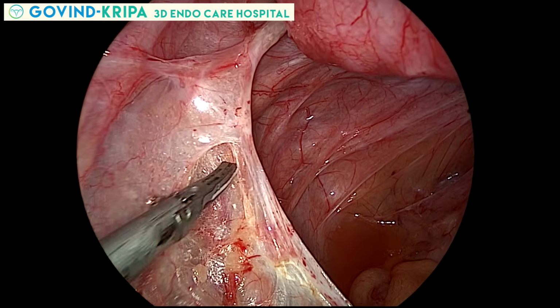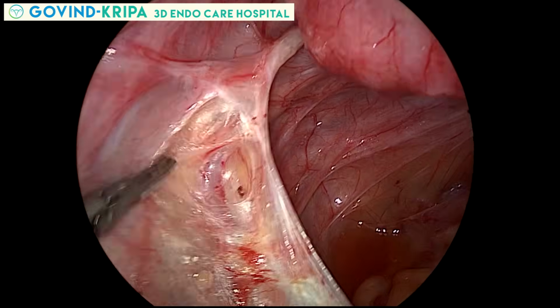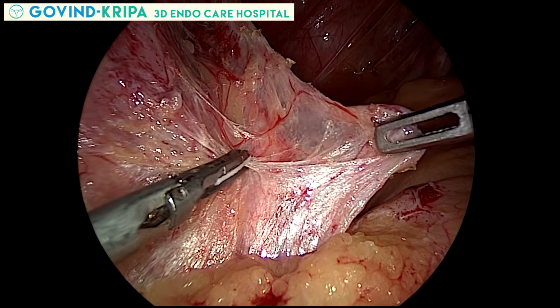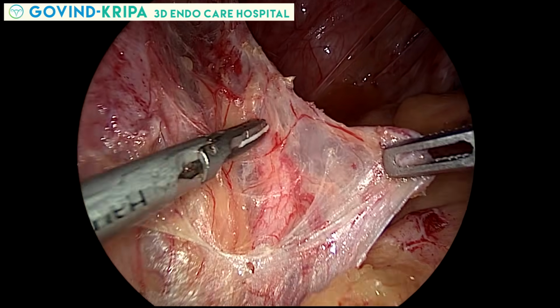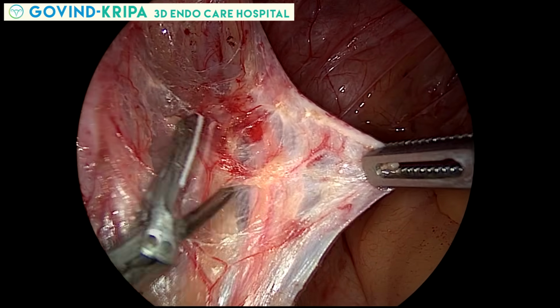After the release of these congenital sigmoid adhesions, ureter is identified at the pelvic brim and peritoneal cut is taken. Ureteric peristaltic activity is seen nicely.